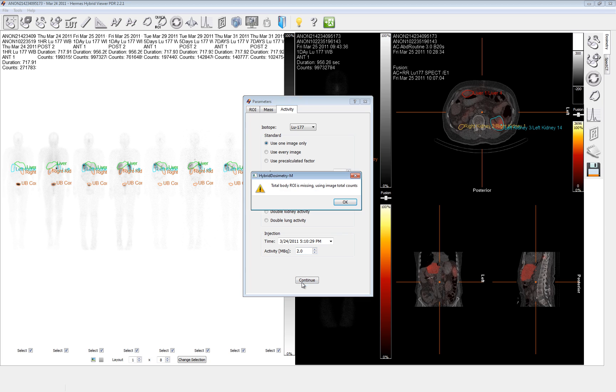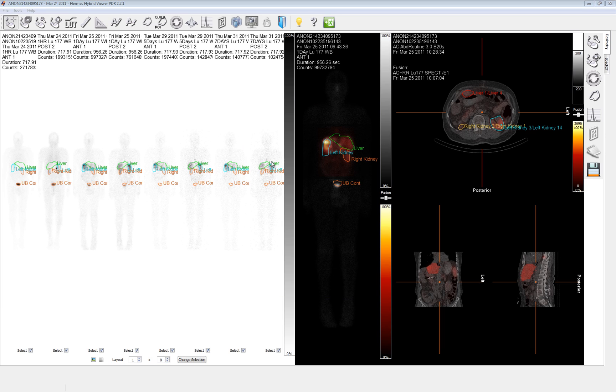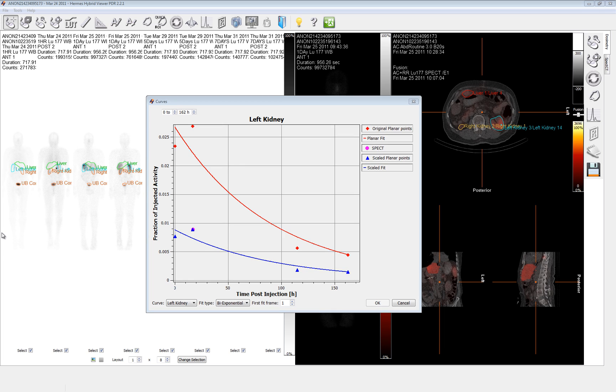So here's the warnings that we're going to get. The first one is that because we did not draw a region of interest for the total body, we'll use the total image counts in its place. The second one, as I stated earlier, is because we did not draw a standard ROI, we'll be using the pre-calculated factor.